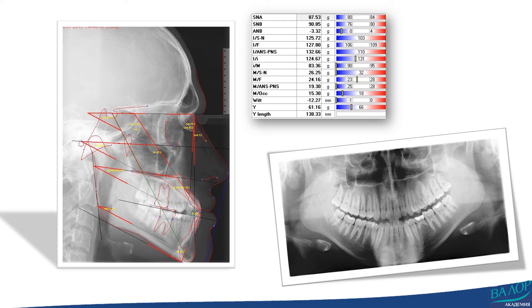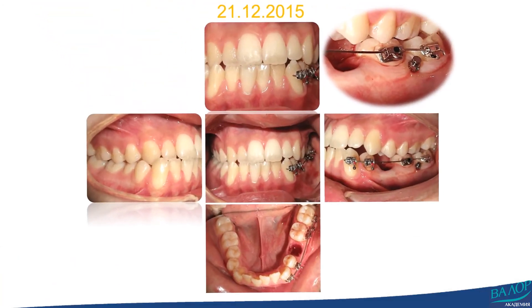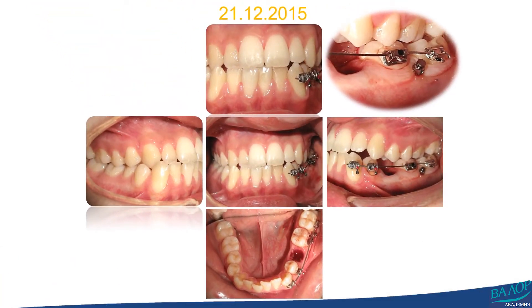On the OPG, one can see a missing lower left second premolar and a persisting second primary molar. In such cases, it becomes obvious that the final orthodontic treatment of skeletal Class 3 should be done after growth has ceased, to avoid situations where we end our treatment and the remaining growth leads to unwanted changes in the occlusion. Such facial skeletal asymmetry in adults can be corrected only by means of orthognathic surgery — more on this topic in videos to come. This patient refused such treatment, which led me to consider orthodontic camouflage and extraction of the retained deciduous lower left second molar.